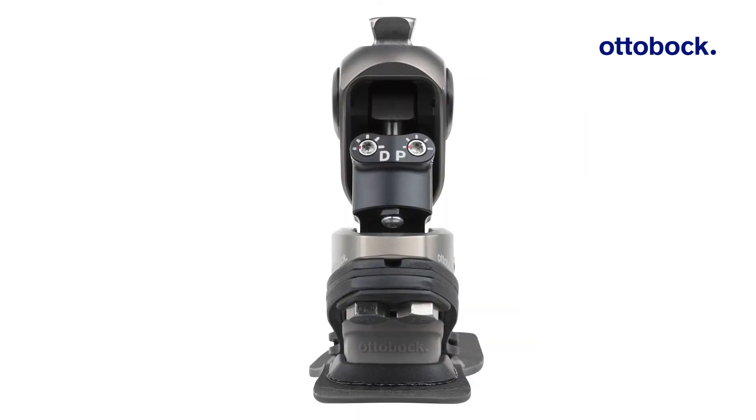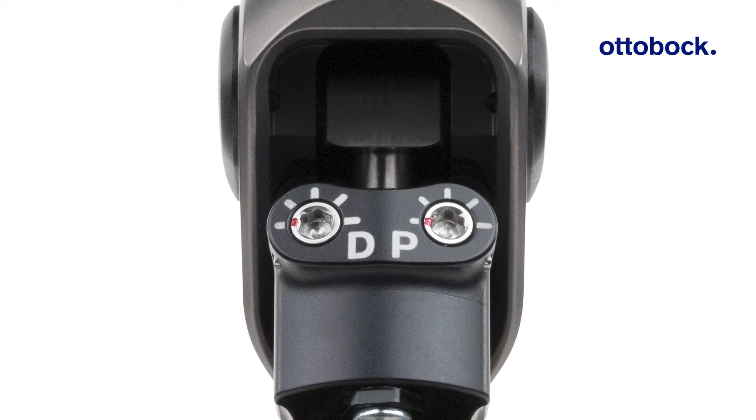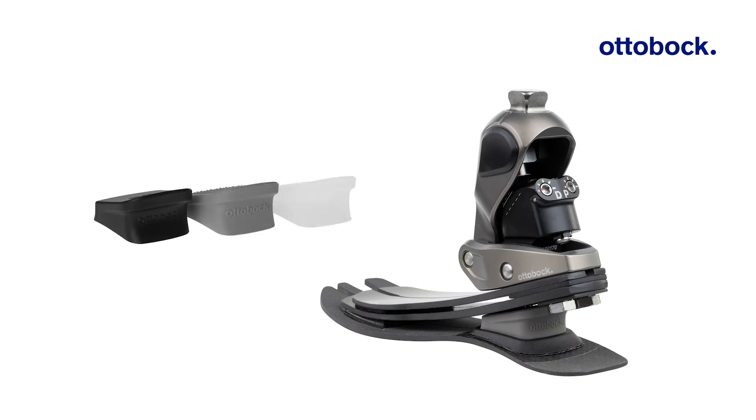On the back of the ankle, the resistances for dorsi and plantar flexion can be individually adjusted to the user's needs with a 4 mm Allen key. The Taleo Adapt comes with three heel wedges which vary in stiffness, and they can be used to further adjust the heel strike behavior when necessary.